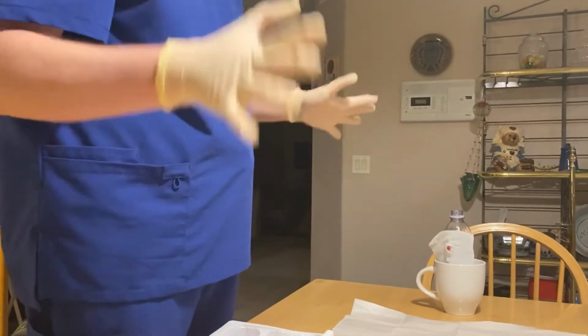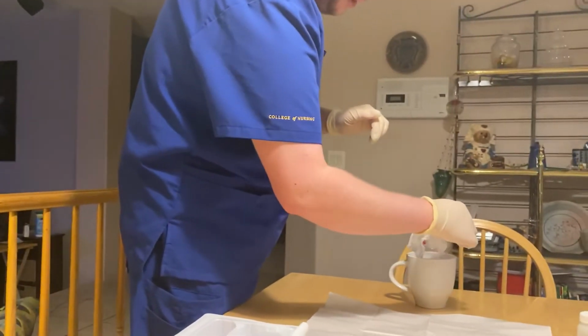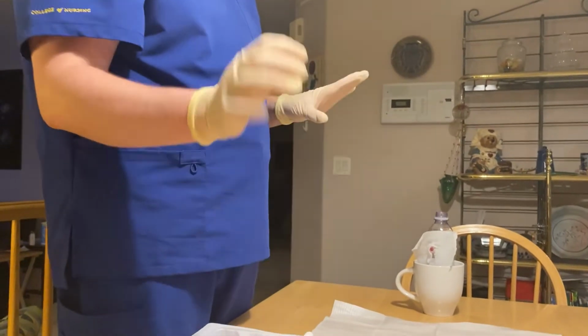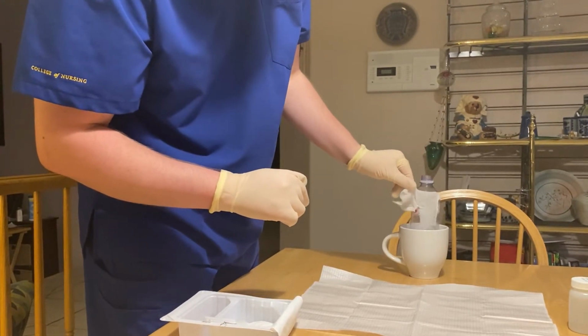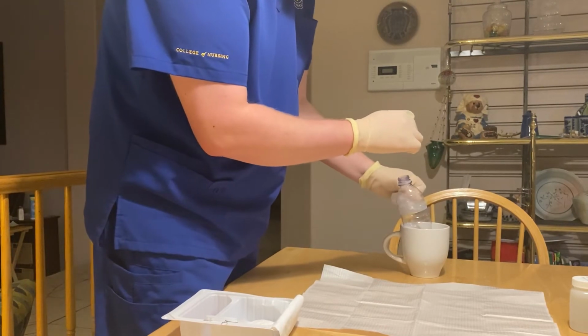Okay, so now that that's all done, I would remove the gauze. Okay, I made a mistake. I used my dominant hand to remove it first. So I'm not going to use my dominant hand. That's what I would fix. I would remove it with my non-dominant hand. Oh God, the trach fell out.